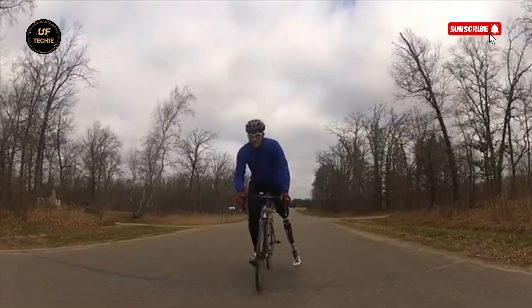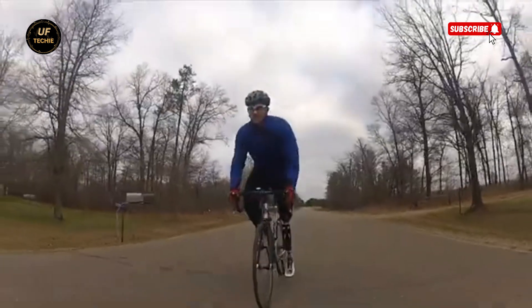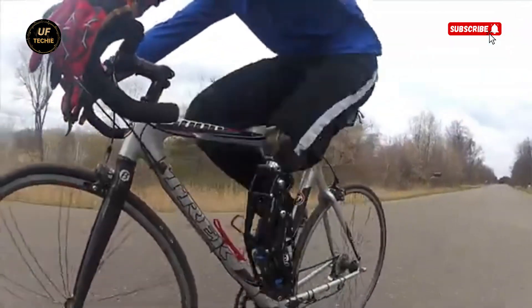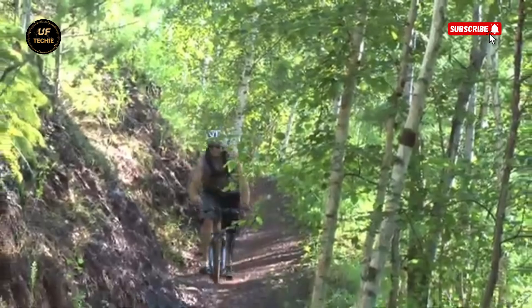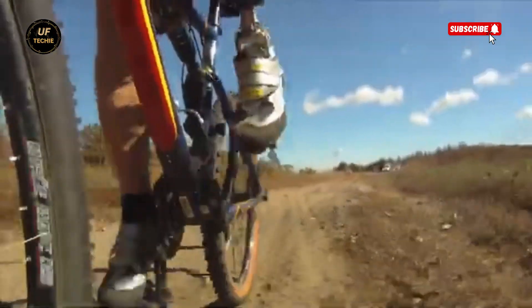The mission at Biodapt is simple yet powerful: help amputees regain their freedom and enjoy an active lifestyle. Whether it's snowboarding, motocross, or downhill mountain biking, their prosthetic systems are designed for real-world, high-impact movement. These aren't passive limbs — they're precision-engineered tools for athletes, adventurers, and anyone who refuses to sit on the sidelines.